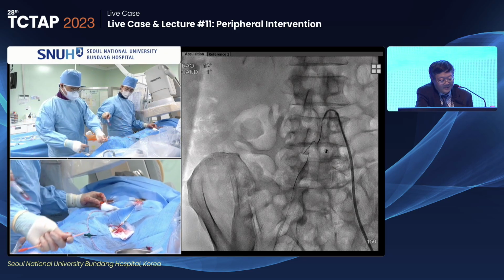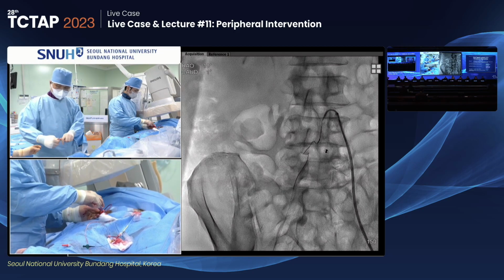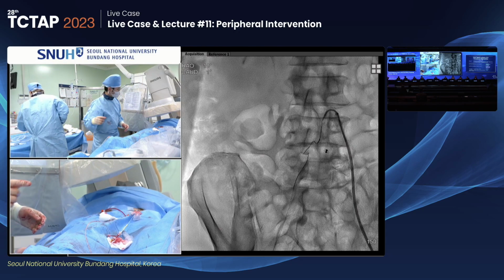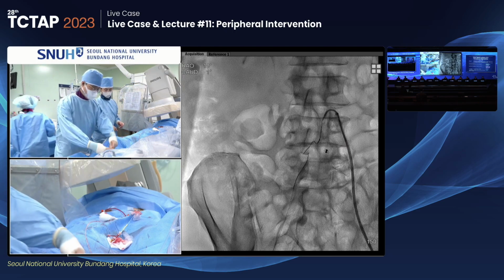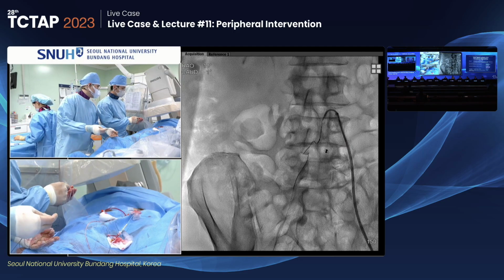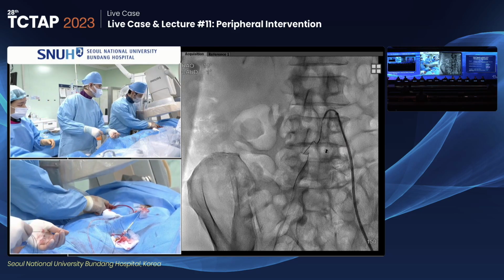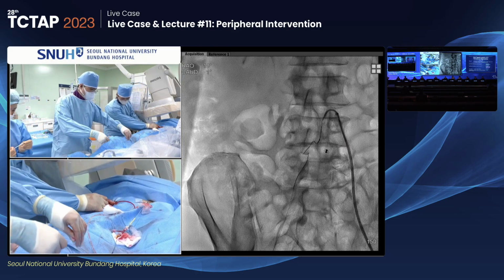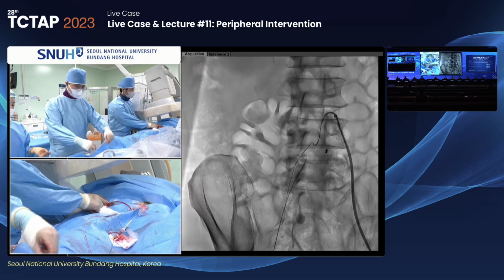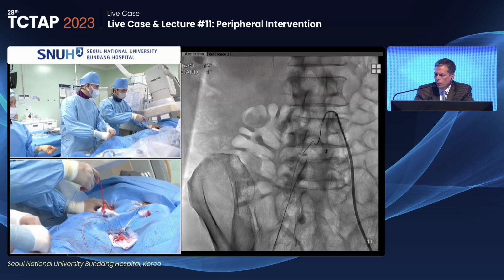13, please, 13. The 035 wire is coming. Terumo. I'll insert the Terumo and the long sheath. So your plan now is a 035 retrograde? Yes, 035 retrograde. I will change the long sheath, which can approach the distal cap, and then I'll check the angio.